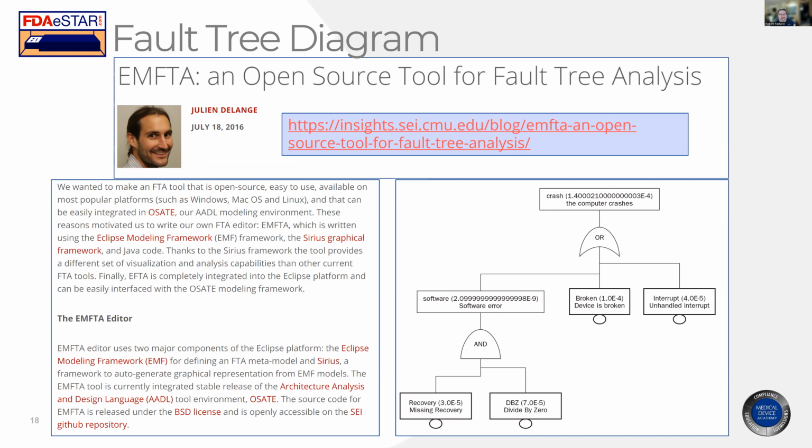And there are some really interesting tools in here. One of them is the basic concept of AND switches and OR switches. So the AND switches, both things have to occur in order for it to fail, whereas the OR, any one of those can fail to cause the failure. The OR possibilities could have your entire system crash because any one thing can cause it to crash. Whereas the AND, this is an extra measure of control you put in your system. Even though this failed, the whole system won't crash. So the AND switches are an extra level of protection in your system.